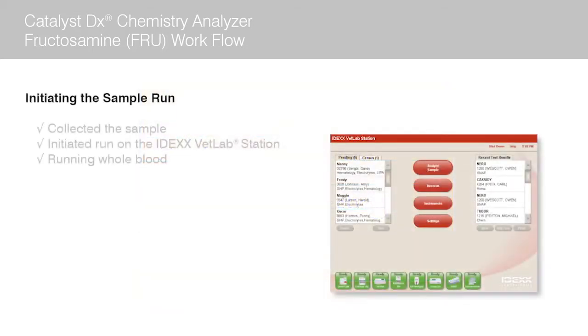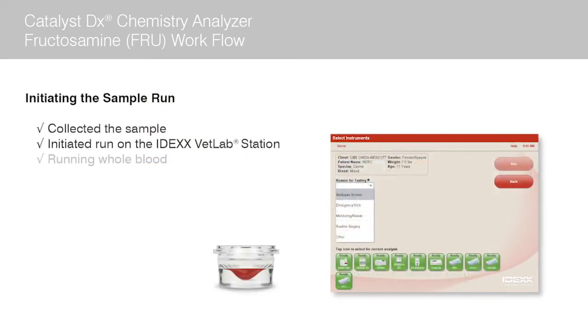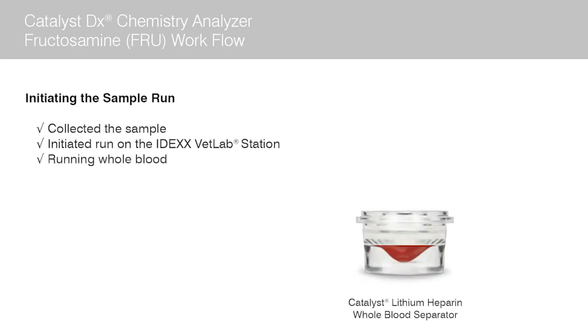For the purpose of highlighting the fructosamine workflow, we will assume we have already collected the sample and have initiated the run on the IDEX VetLab station. We recommend running whole blood so that you can have and share results during the patient visit.